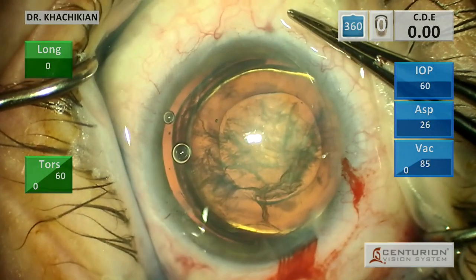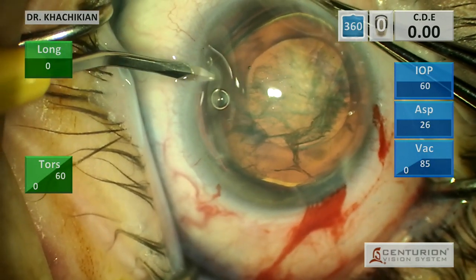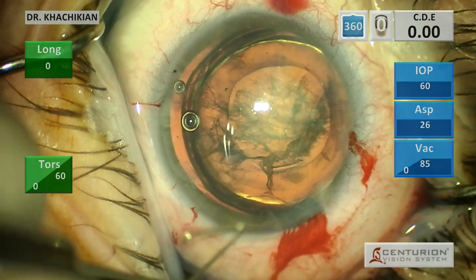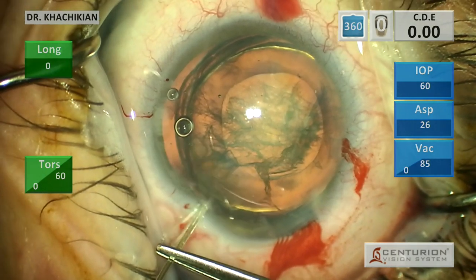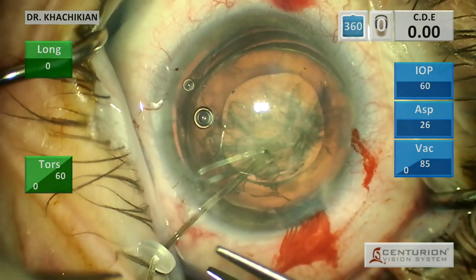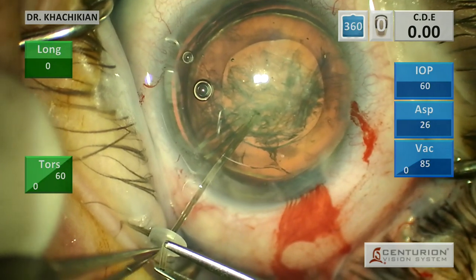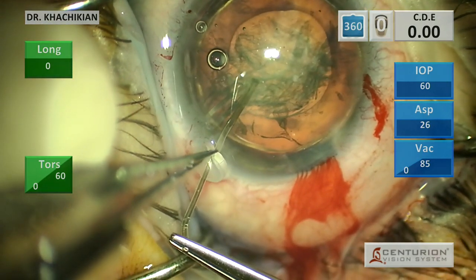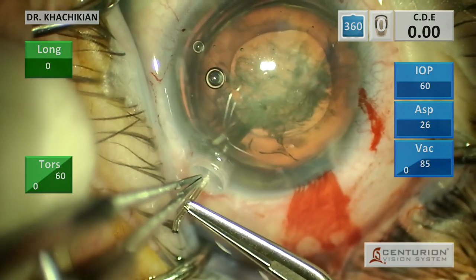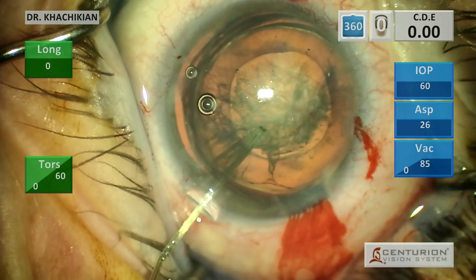We've done a hydrodissection and hydro-delineation, and then we put a little bit of viscoelastic in between the capsule and the cortex - although I don't actually know if we've got that, you just can't really tell surgically. Now we're going to use our capsular hooks. You can see it's got that duckbill shape. We poke it in there, we've created the space with the viscoat, and we're just going to try and get it as far back into the fornix as we can. That's why I have a larger capsular rim and a smaller than average capsulorhexis - it gives the capsular hook a larger area to purchase as it's doing its job, and the larger area the tension is spread out over, the less likely the hook is to damage the capsule.